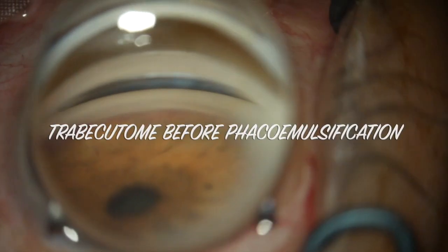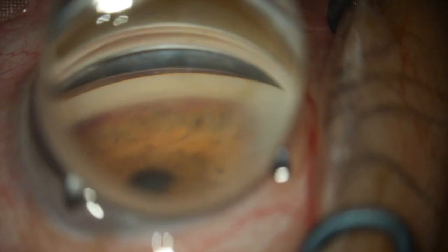Do the trabectome surgery before phacoemulsification. This ensures a well-formed anterior chamber through only a paracentesis incision as opposed to a wider corneal wound created for a cataract surgery that would lead to wound leak and unstable anterior chamber.